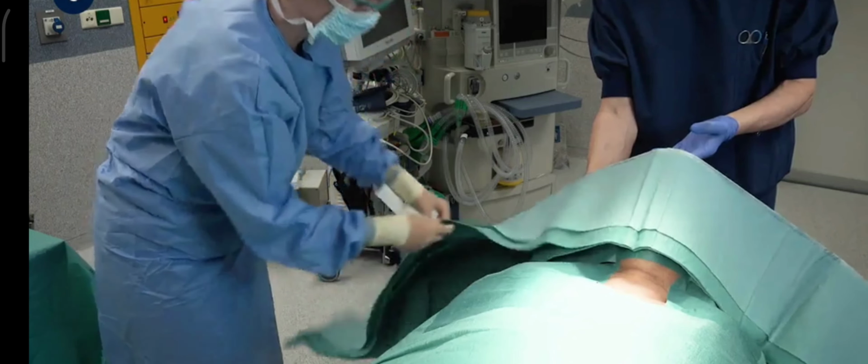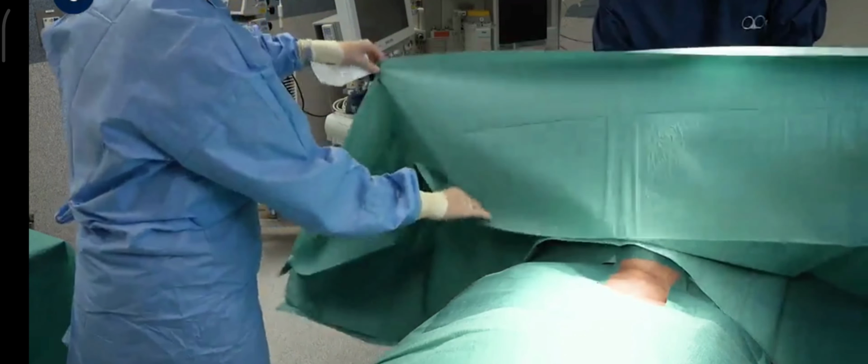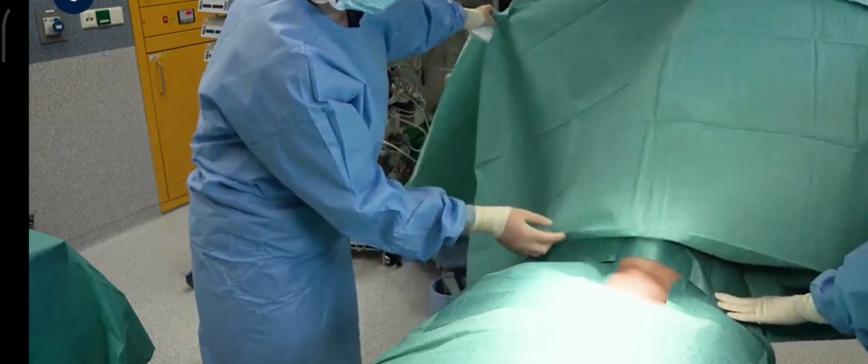The anaesthetist maintains control of the ET tube as draping is completed. Again, take note that normally an anesthetic stand would be present, but was not shown in this film to aid visibility. Square draping of the neck is now complete.